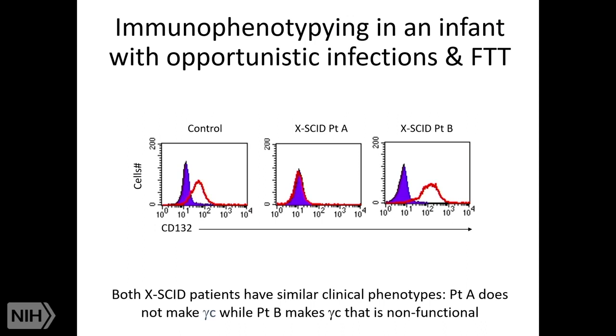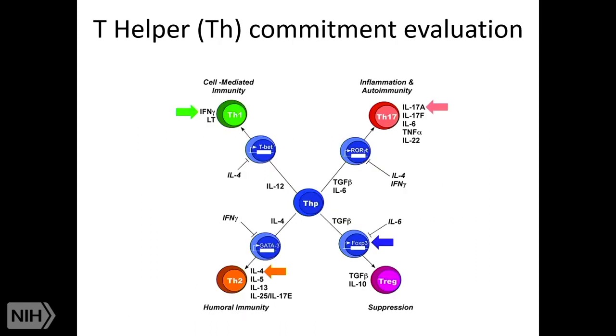And this is to reinforce the idea that whenever you are doing certain tests, you have to know what you can expect from those tests. Flow cytometry will not tell you in this approach that the protein is working, only that it is there. Make sense? Please, one yes. Yeah, okay. Thank you very much.